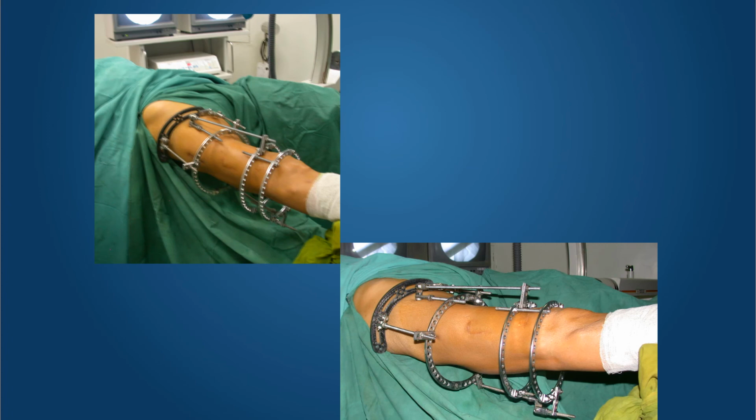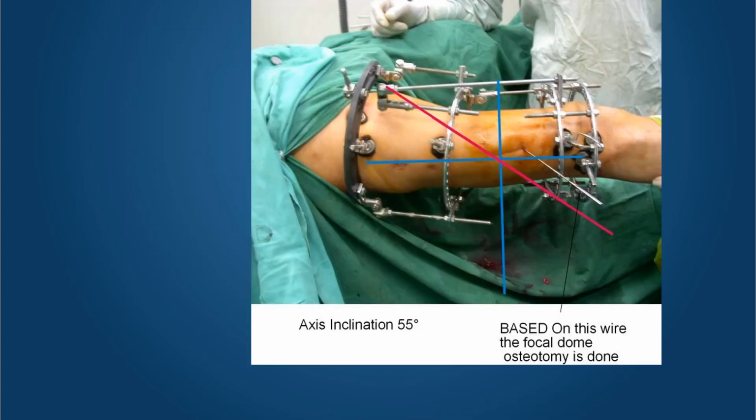In the inclined focal dome, the hinges are not located one above the other as is seen in simple oblique plane deformities. You can see over here that the upper hinge is placed much proximal to the ring and the lower hinge is placed at this level. So this is the inclined plane that you can see. The red line denotes the inclined plane.